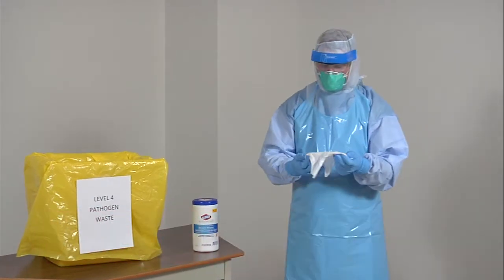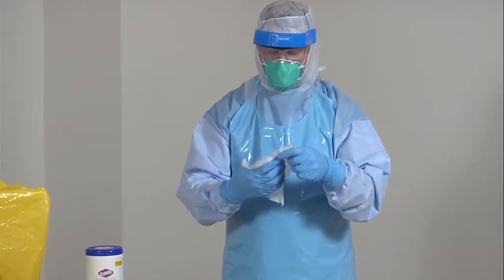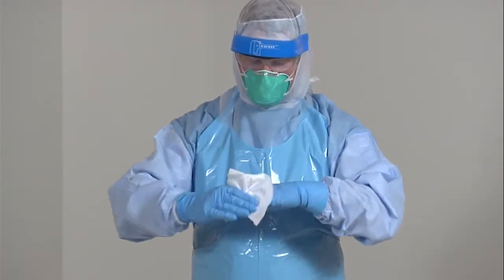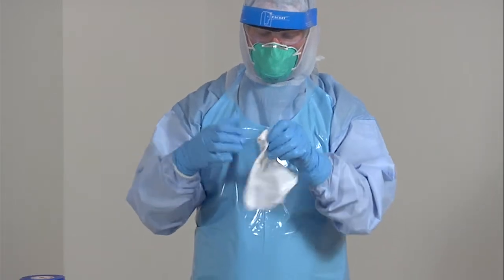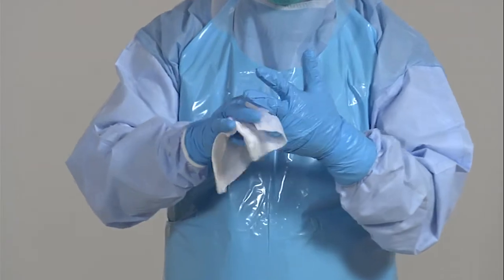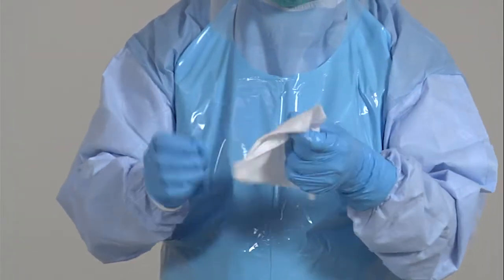Wash your gloves with a bleach wipe, making sure to wash all areas of your gloves. Dispose of the used wipe in a Level 4 pathogen waste bin.